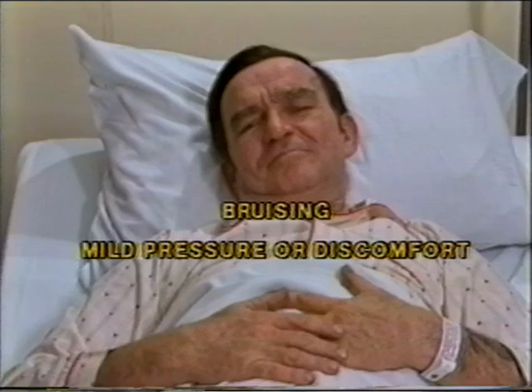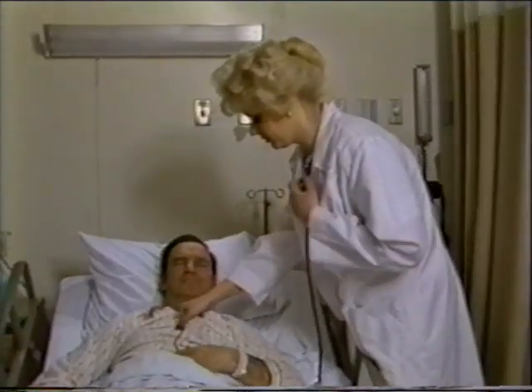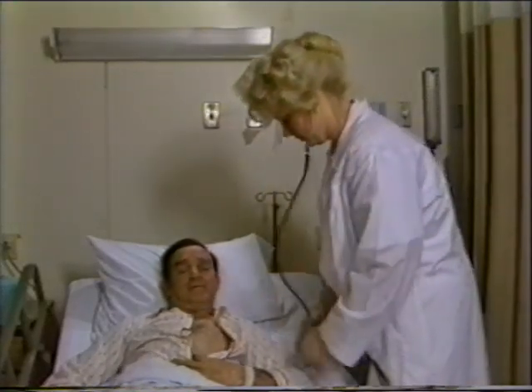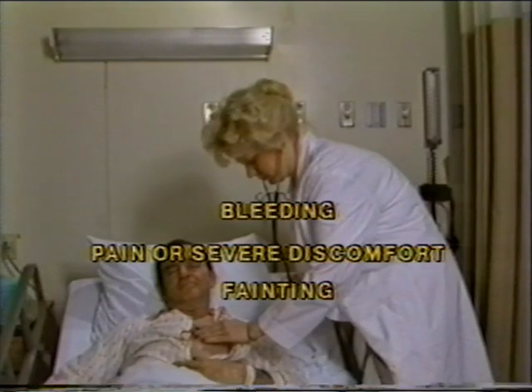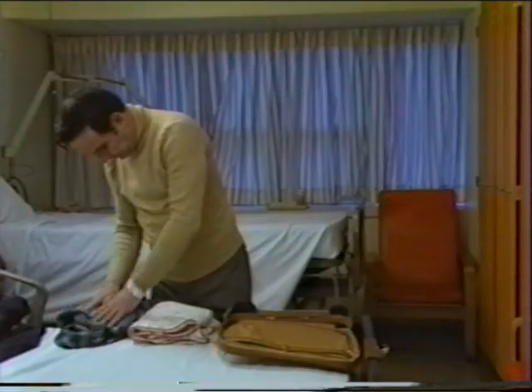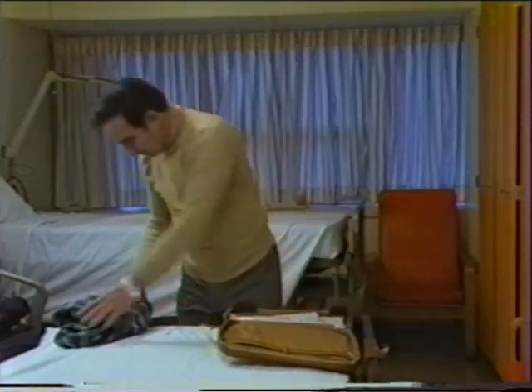You may experience some minor discomfort after your cardiac catheterization, such as a bruise where the catheter entered, mild pressure or discomfort in that area, lightheadedness, or mild indigestion. These minor problems may be expected, and you should not be alarmed. There are other problems which may be more serious and should be reported to your nurse immediately. These include bleeding where the catheter entered, severe pain or discomfort in this area, fainting when sitting up, and severe nausea or vomiting. As prescribed by your doctor, you may go home and resume some activities, usually the day after the catheterization procedure.